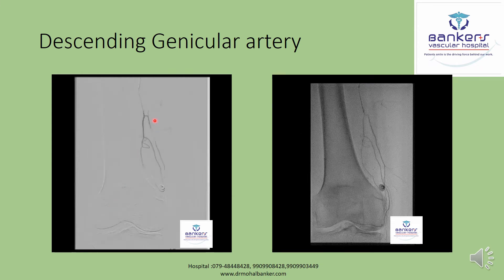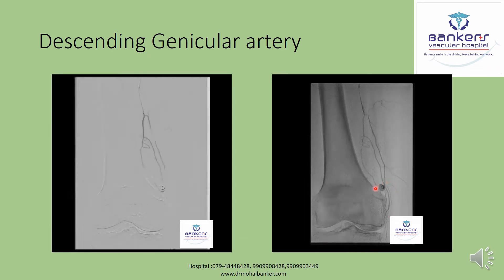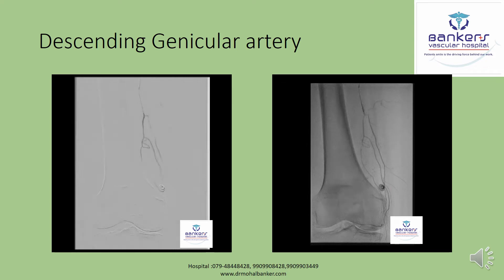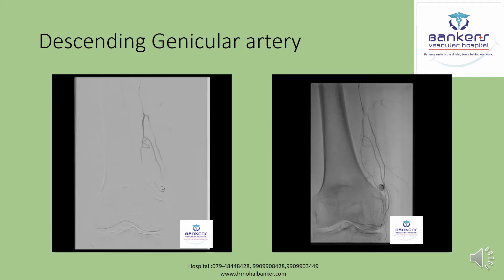These are the descending genicular artery — the first artery supplying the medial side of the knee joint. You can see the markers positioned here, and the branches of this descending genicular artery pass through these pain-producing sites. However, there is no hypervascular artery here, so this artery is not participating in the inflammatory reaction at the pain-producing sites.